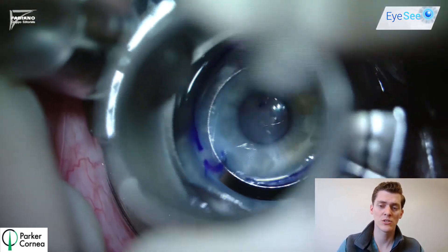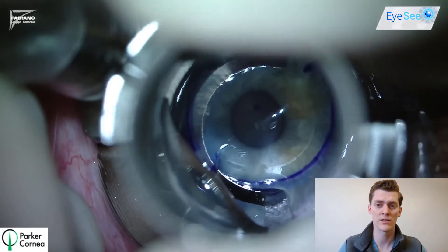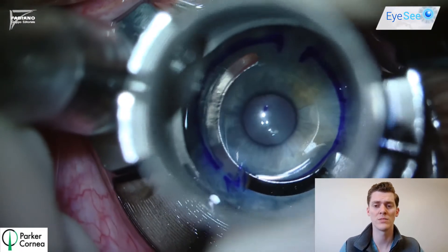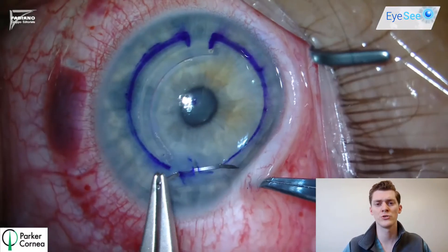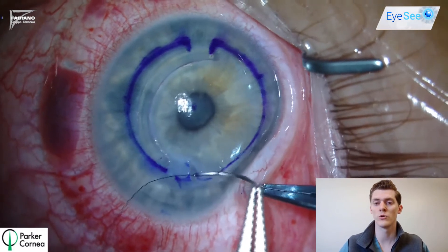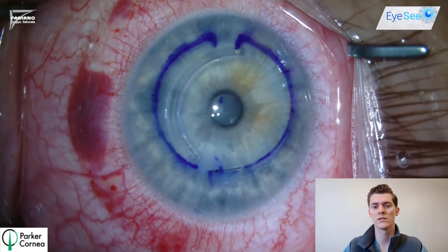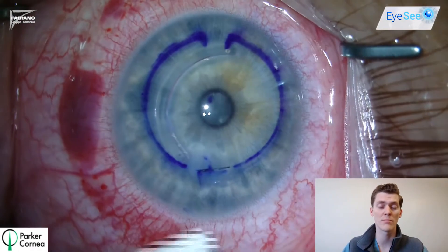However, the semicircular channel is supposed to follow along the marked lines with gentian violet, but as you notice it drifts a little bit towards the visual axis, which could be in part because the dissection was slightly more anterior than what we're used to. We also used a suture in this case because we wanted to make sure the wound was indeed closed. After burying the knot, we used a Weck-Cel to ensure that the wound was not leaking.